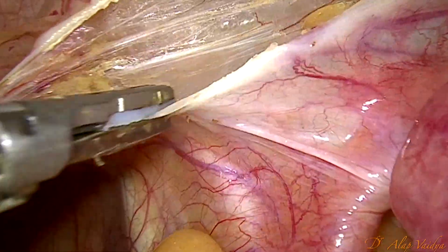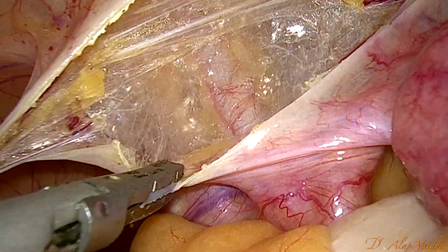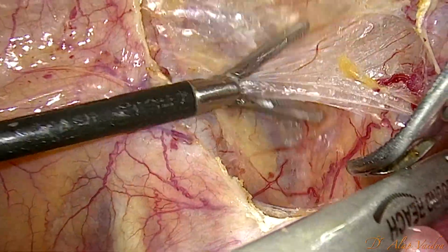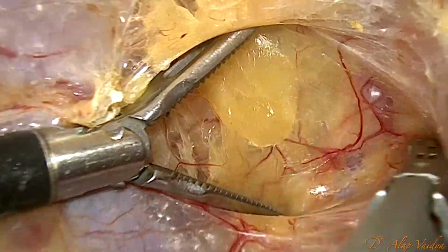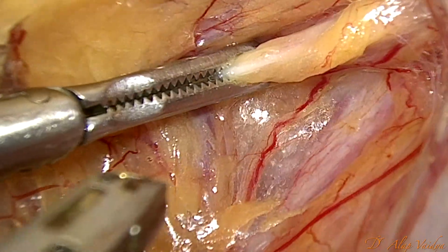Now I am cutting parallel to the IPL. We can see the external iliac artery. Now we have to find the ureter first. And as soon as we find the ureter, boom, this is the uterine artery.